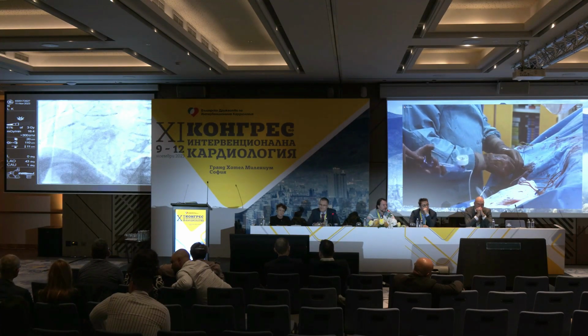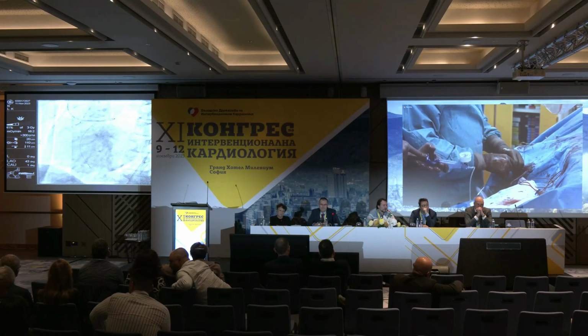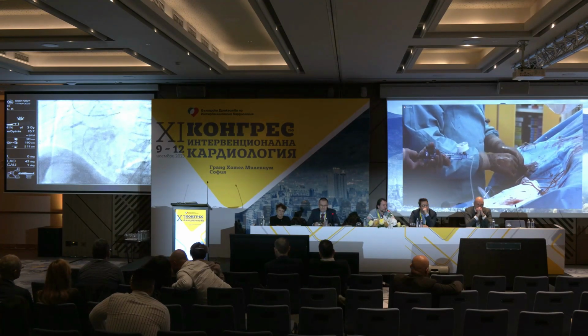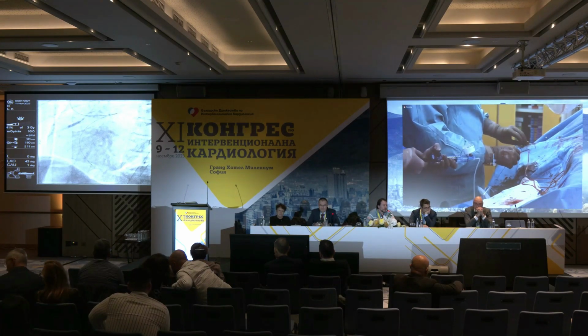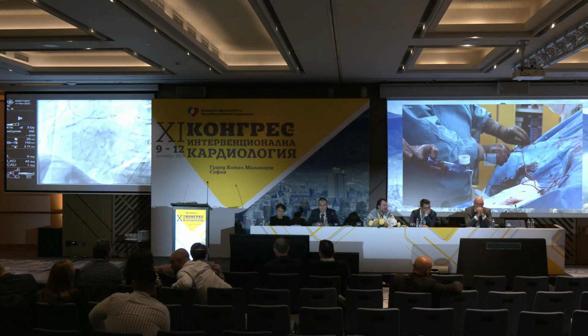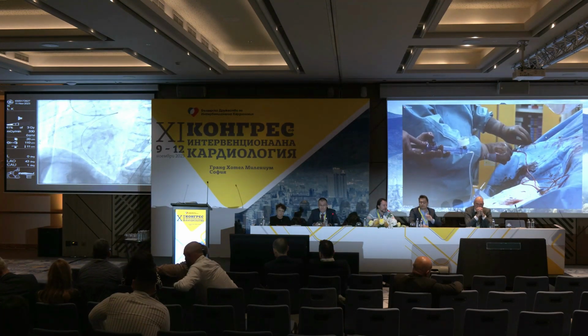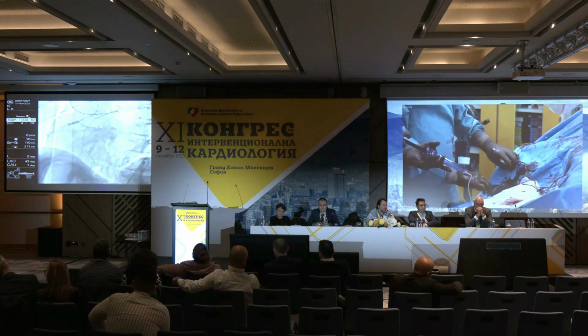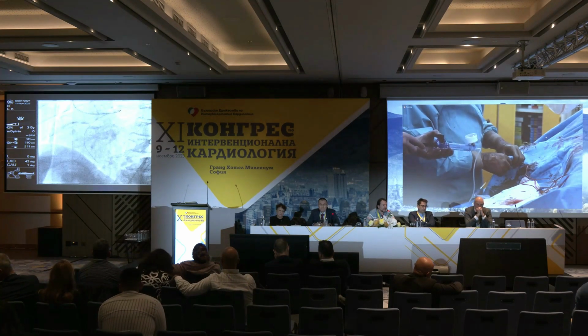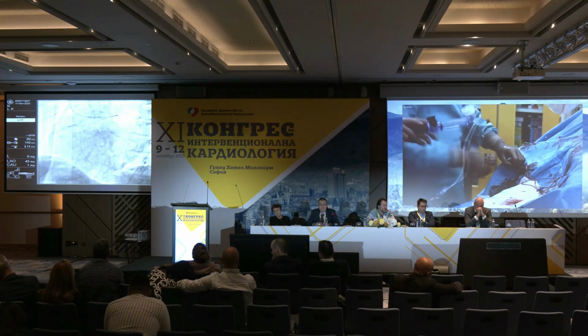So this is the important trick here. George didn't push his guiding catheter, so he can maybe destroy the struts of the ostium. So he will do his post-dilation and then he will do it down, as he is doing it now, by deflating the balloon and pushing the guiding catheter. So you see that the guiding is already into the stent. Yeah. So the ostium, exactly, the struts of the ostium are safe in this position.